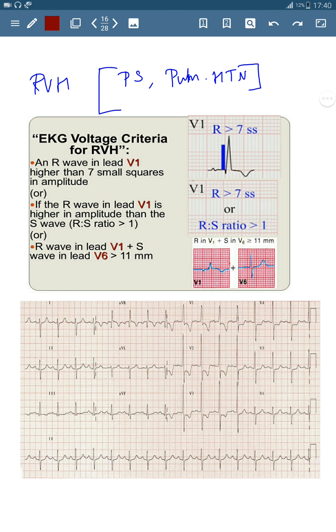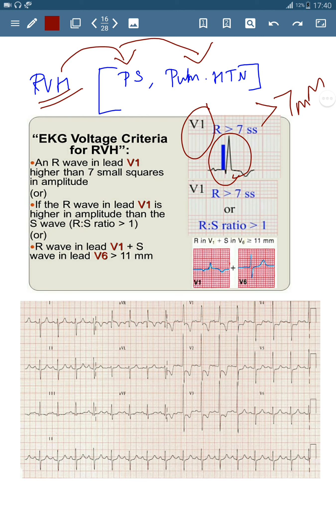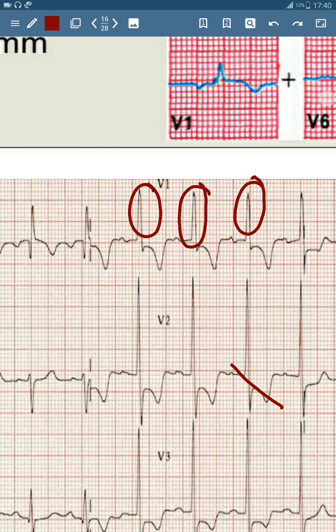Right ventricular hypertrophy can be caused by pulmonary stenosis or pulmonary hypertension. The criterion for right ventricular hypertrophy is that the R wave in V1 should be more than 7 mm. In this ECG, you can see the R wave in V1 is more than 7 mm, indicating right ventricular hypertrophy.